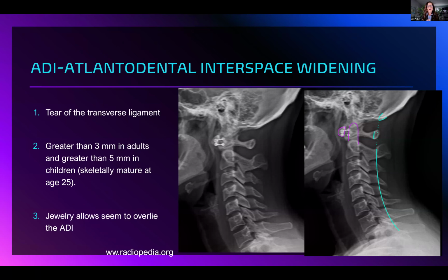So with that, we have to then look at the flexion x-rays and extension x-rays as well. But if we do see increased widening, typically it's on the flexion x-ray. So it can be on the neutral lateral being wide and or flexion.